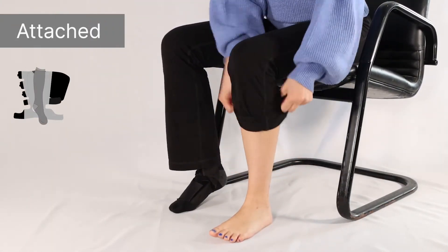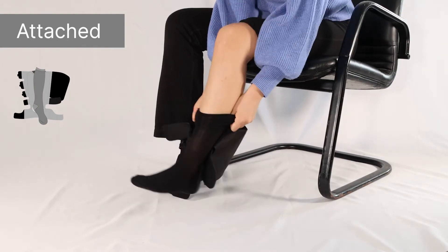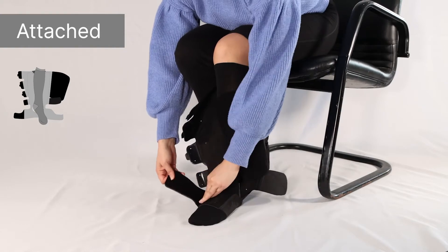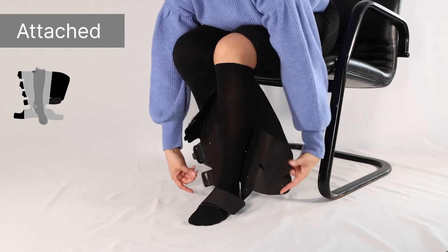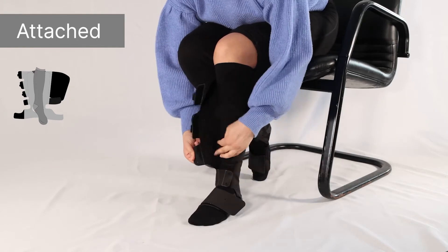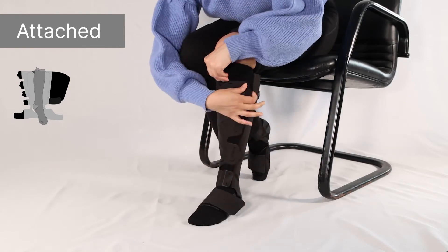AeroWrap can be worn with the integrated undersock pre-attached by pulling the undersock up with the sleeve open. Begin securing the strap starting with the foot strap, then the ankle strap, and continue up the leg adjusting where needed for a snug and comfortable fit.